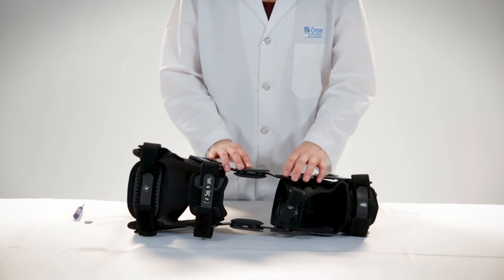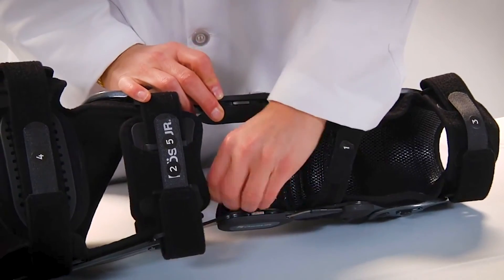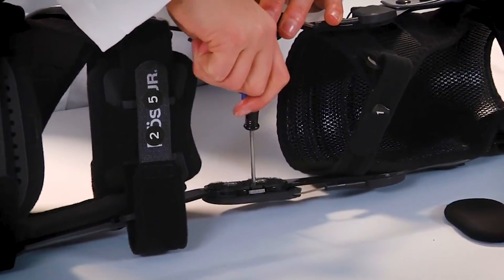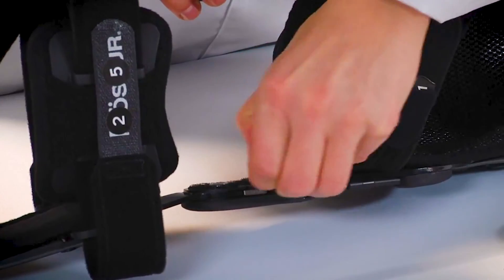The device comes with a zero-degree extension and 105-degree flexion installed in the hinges and includes the additional flexion stop of 90 degrees. Peel condyle pads from hinges to reveal stop slots and retaining screws. Using a screwdriver, remove the retaining screws and slide out the unfastened stops.